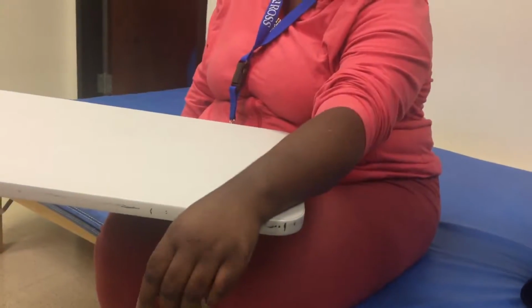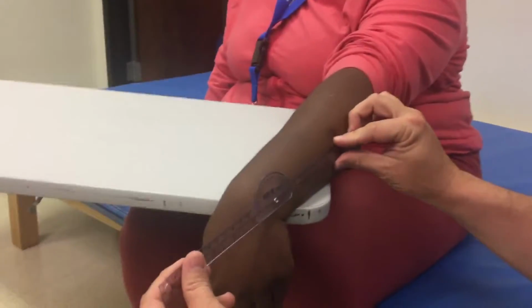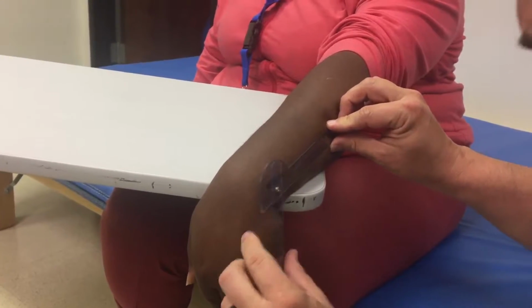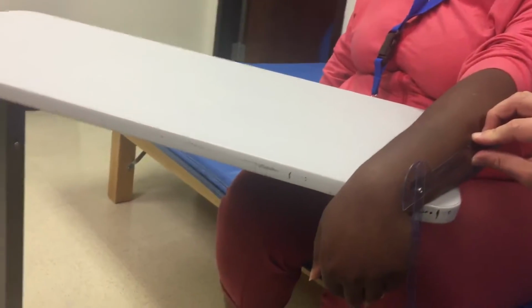And so then I'm going to ask her to bend her wrist down like this. I'm going to line it up just distal to the ulnar styloid. I'm going to have the stable arm still lined up with the middle of the forearm, and then I'm going to line up the black line with the fifth metacarpal. And that's it.